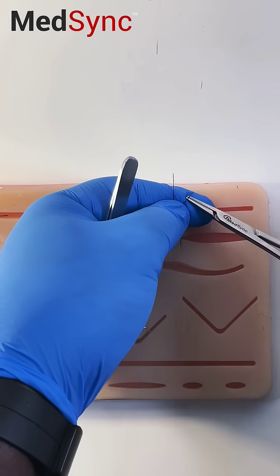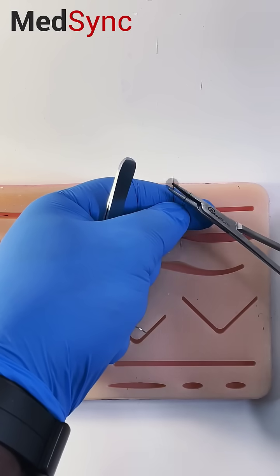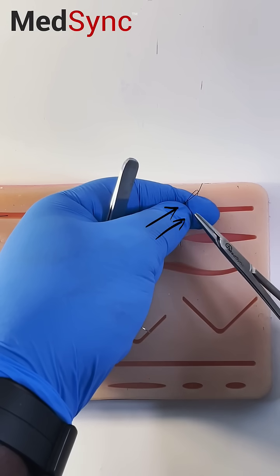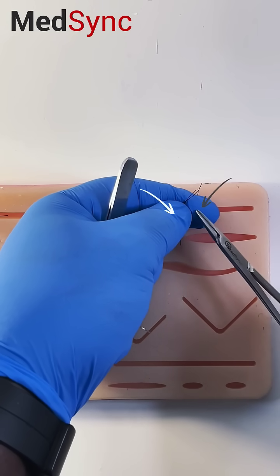Go under the long suture and pull the short suture through, but keep this knot squeezed between your thumb and index.